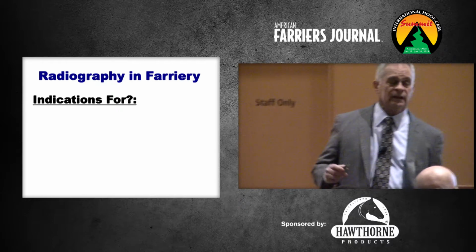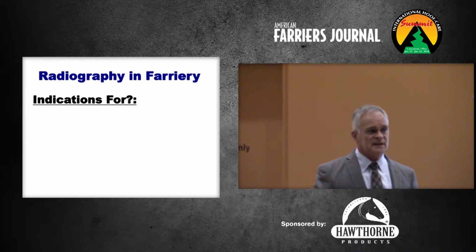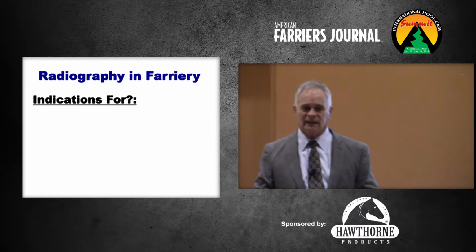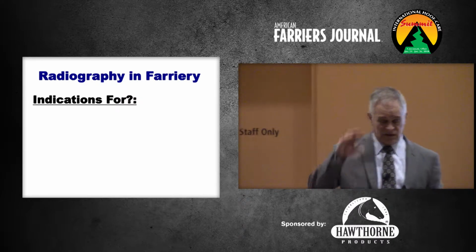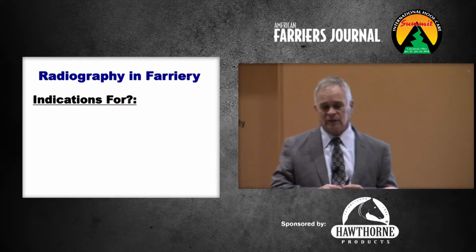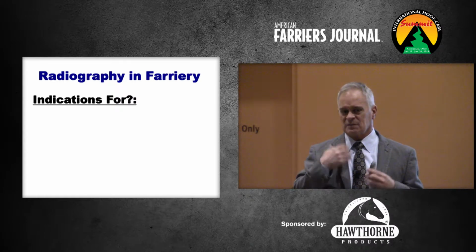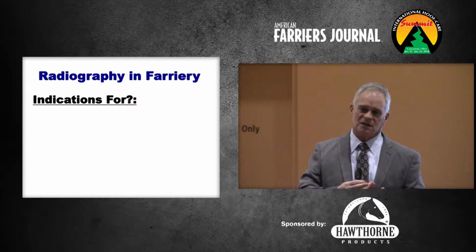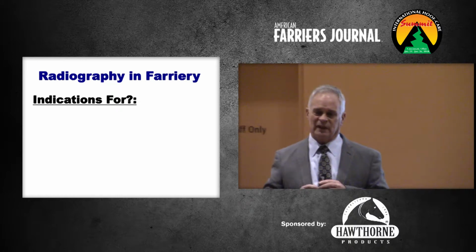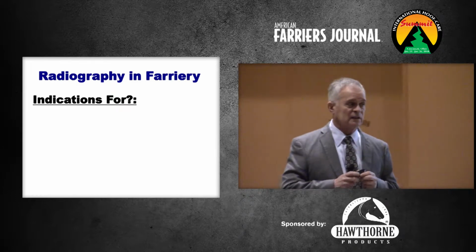Joint spacing, okay. So maybe the radiographs will help us evaluate joint spacing or joint angle to help us decide on balance or things like that. I will say, as a caveat, judging joint space can be really hard with radiographs, because just a little bit of off positioning can alter it. So there have been a lot of times I think it's been misused or abused. Even just the horse leaning can really change a joint space. So if you're going to use it for that, you have to be really, really careful and really, really accurate.